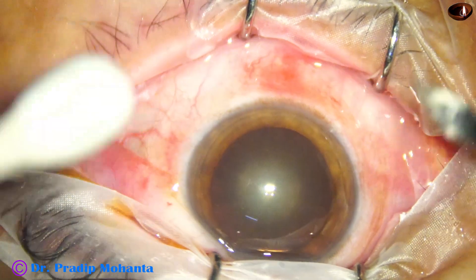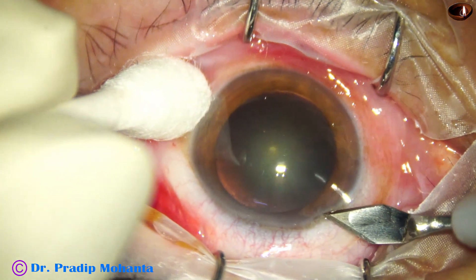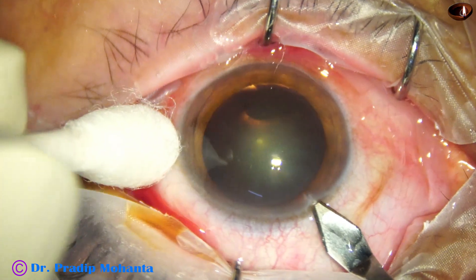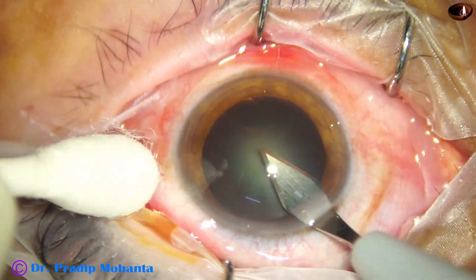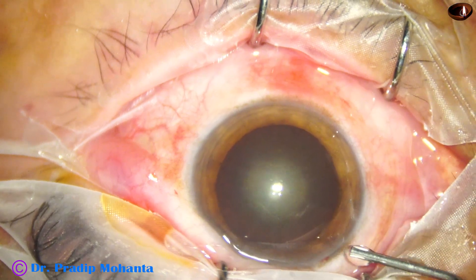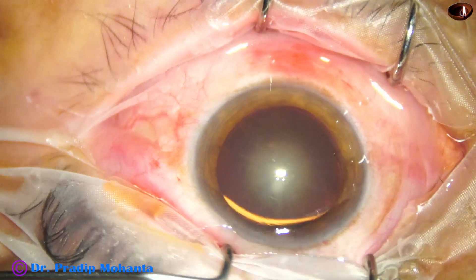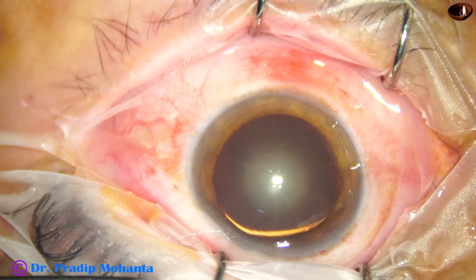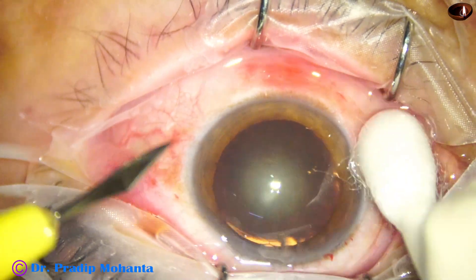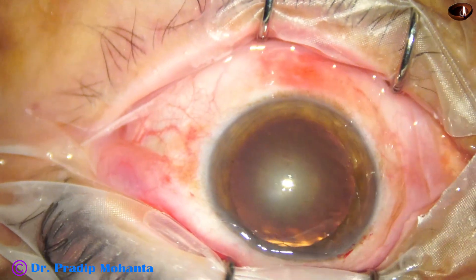The ocular surface has been thoroughly irrigated applying few drops of povidone iodine. Now this is the main incision with a 2.8 millimeter steel keratome. The anterior chamber is filled up with 2% hydroxypropylmethylcellulose, and now the side port is made about three clock hours away from the main incision.